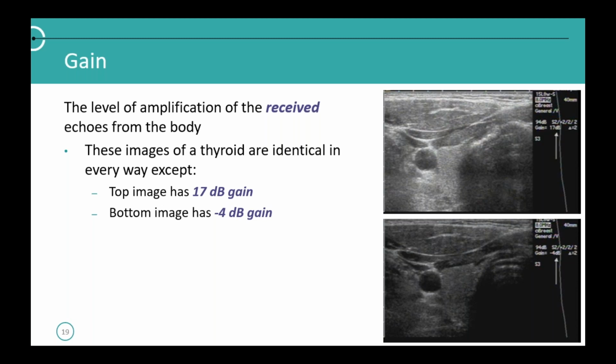Are there oftentimes auto gain? Yeah, mm-hmm. For these types of settings, the user isn't necessarily setting these every time they're taking an image. Right. It's one of the things that in a preset you can select whether you want auto gain on or off. Typically, as soon as you start scanning, the auto gain kicks in and auto adjusts. But if you make a change to that setting, it sort of disables that temporarily. But yeah, that's a good point. The newer scanners have this auto gain, and different manufacturers call it different names.